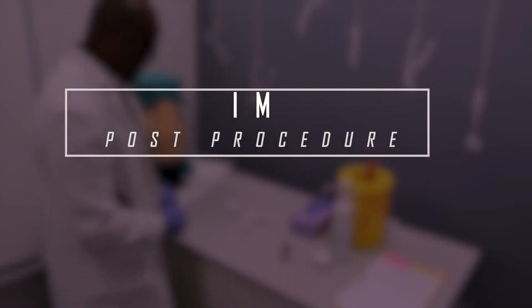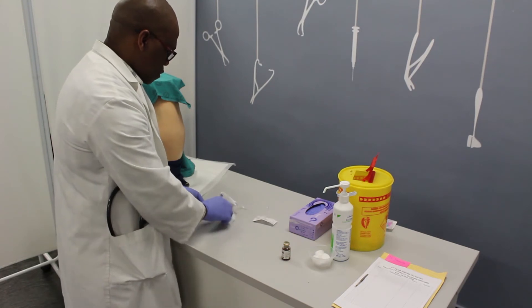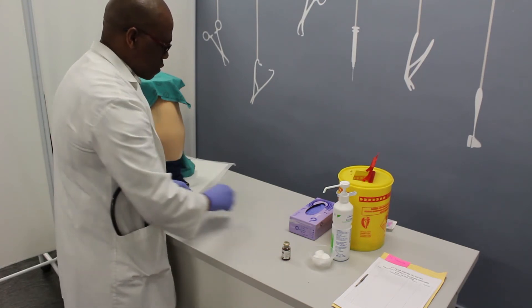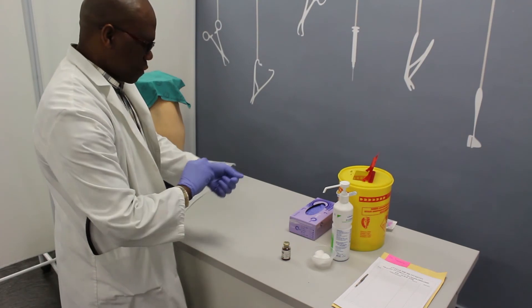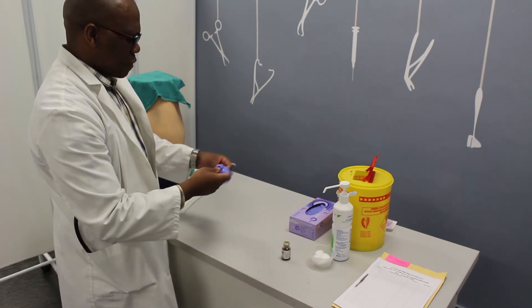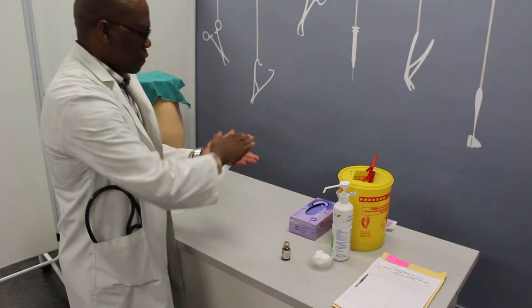Post procedure: thank the patient and ensure their comfort. Discard all used medical waste into the red bin, and discard any used general waste into the clear transparent bin. Remove your gloves. Disinfect your hands with disinfectant.